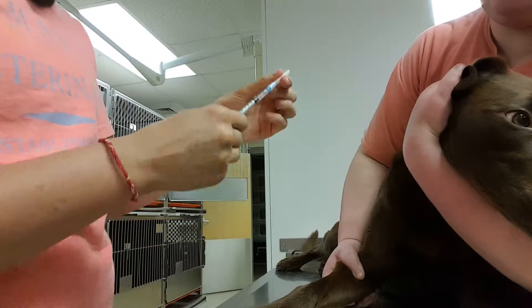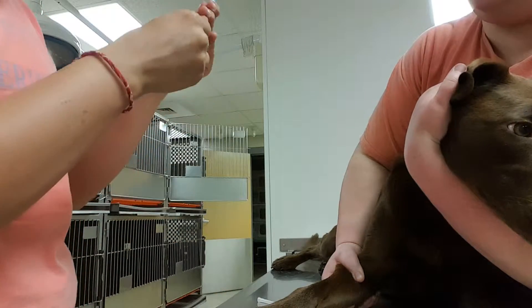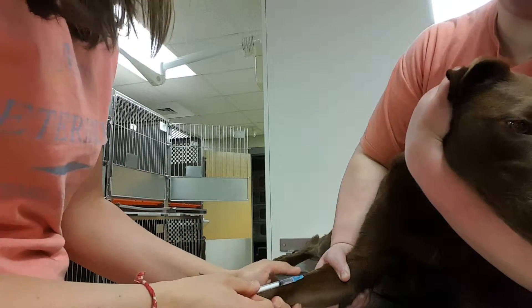Now I'll make sure my needle is beveled up, and I'll go in at the correct angle and just thread my needle right into the vein.